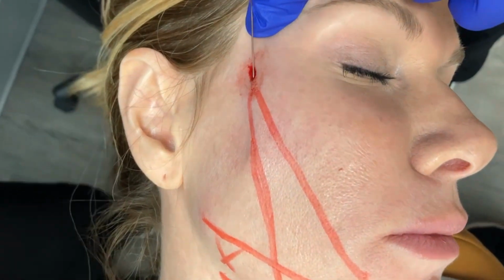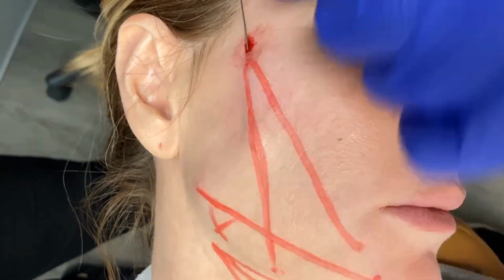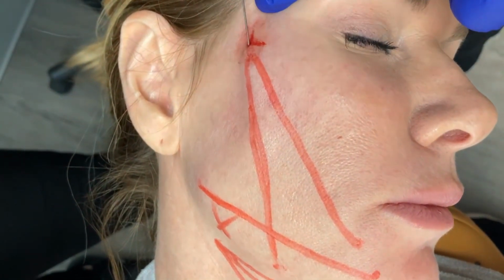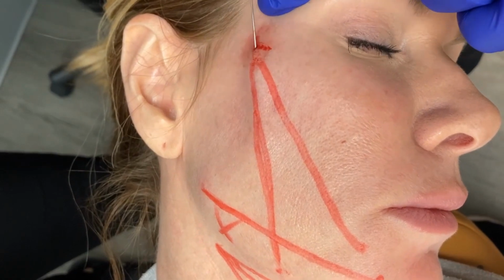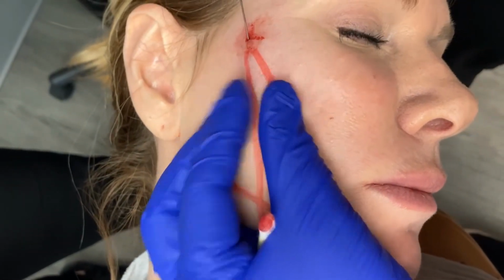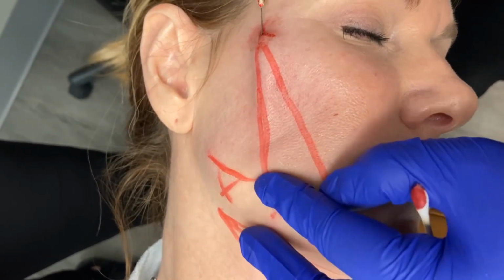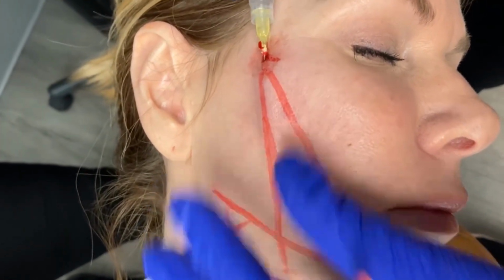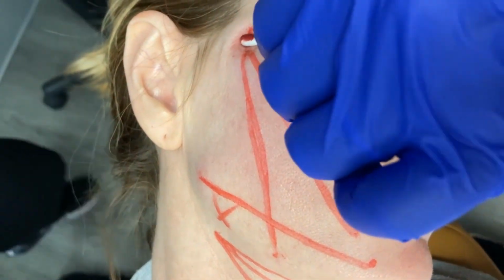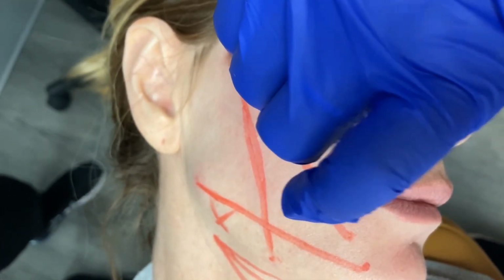Sometimes you may hit a little bit of a barrier, give a little bit of lidocaine, and so many times you'll be able to pop right through there, and your life will be a lot easier here. But make sure you take your time with this, and you're never forcing anything. That is a critical piece of advice, because you see many times people are jamming things in here, and that is not going to work, and it can become much more dramatic than it really needs to be here. So you can see this is going just fine. We were able to pre-tunnel that, give some lidocaine on the way out, and that's going to make this procedure so much more comfortable for the patient.